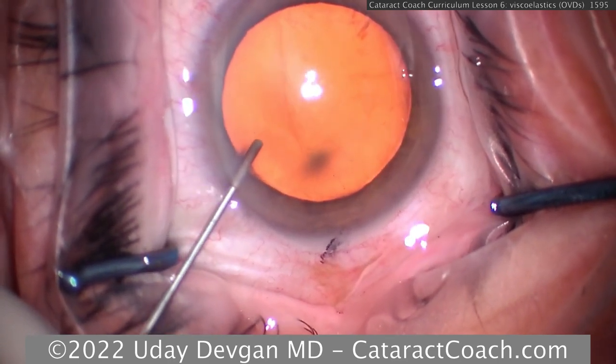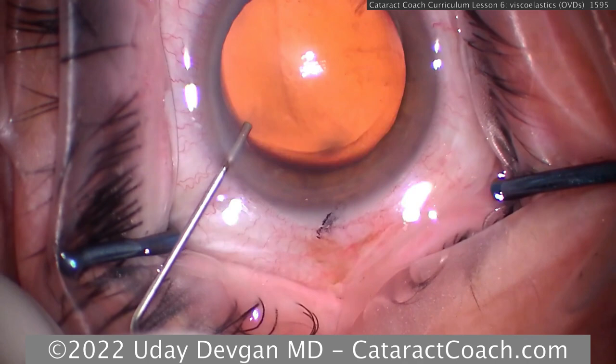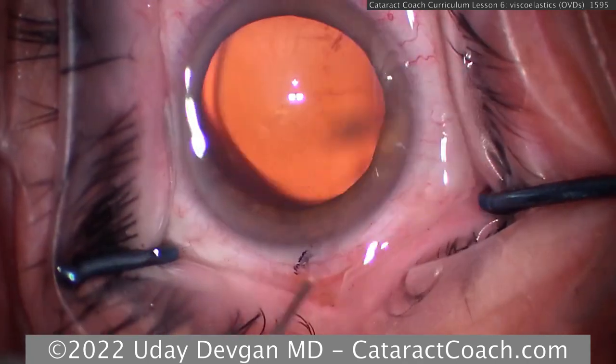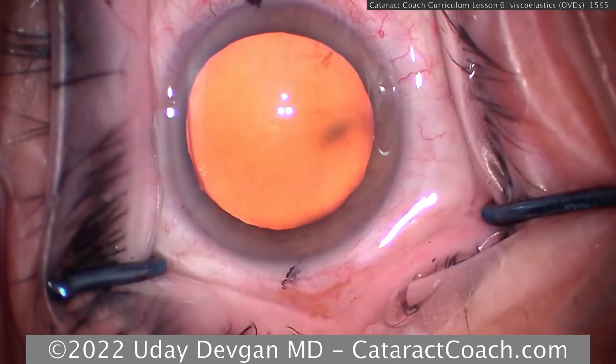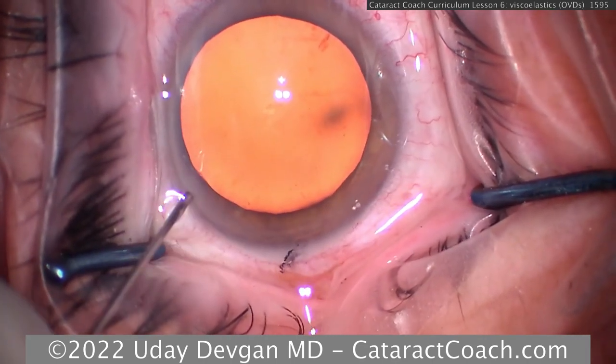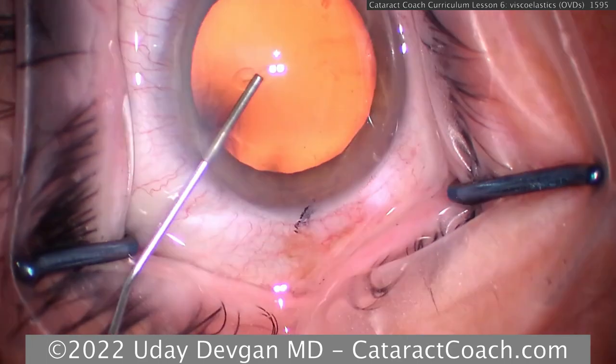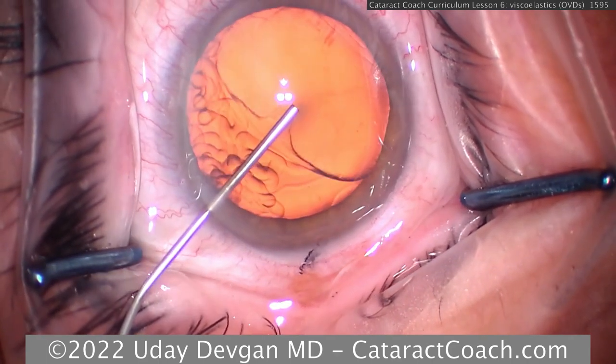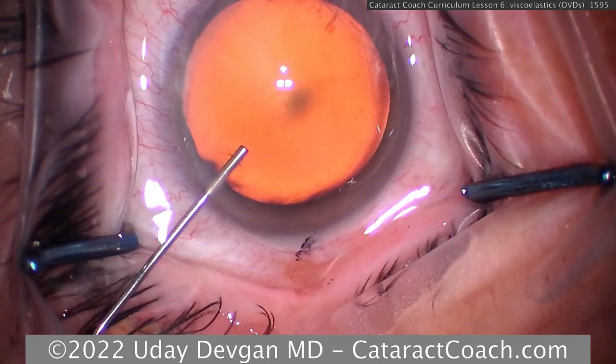When we put the dispersive viscoelastic in the eye, the goal is to coat the corneal endothelium, but also to completely fill the anterior chamber. So we want to do an exchange. So viscoelastic going in the eye, and then we want the aqueous coming out. So we come across, and if I push slowly on the plunger, see, you get all that spaghetti? That doesn't work. That comes right out of the eye.